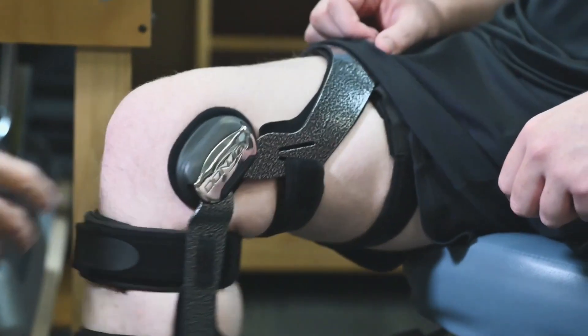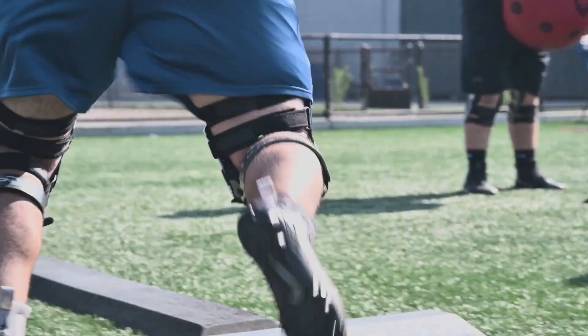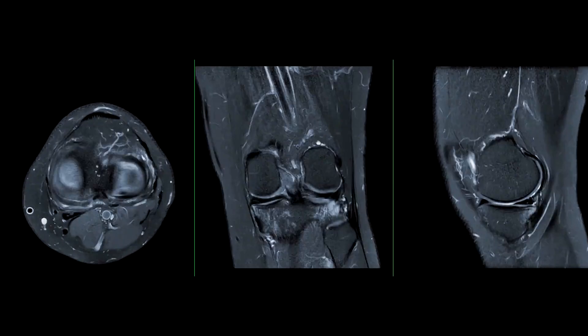We typically use the Donjoy Armour brace for all of our linemen with the MCL and the valgus force that they may take getting rolled up into or contacted by, just by the nature of their sport and being on the line. But imagine that force on the knee without a brace.